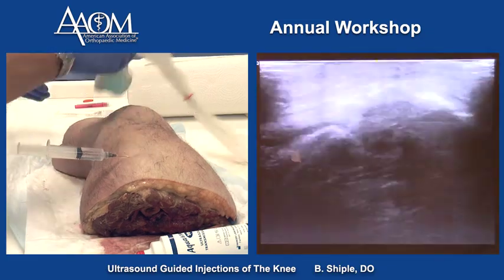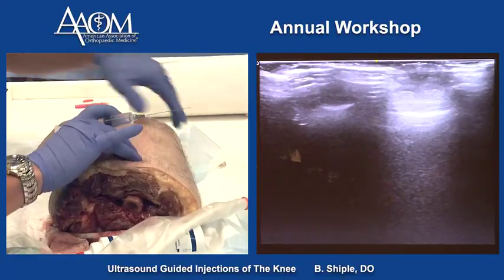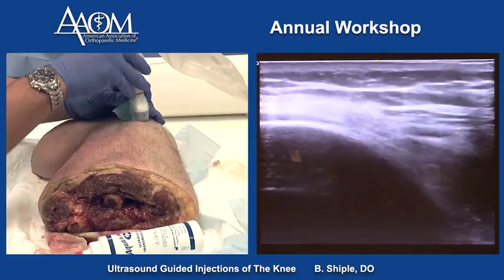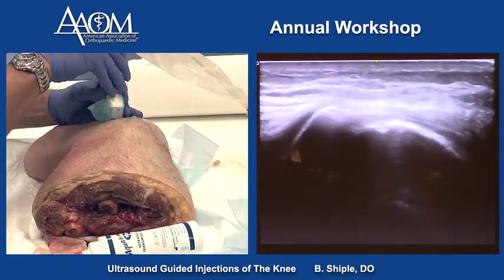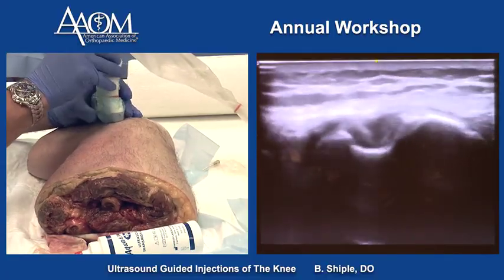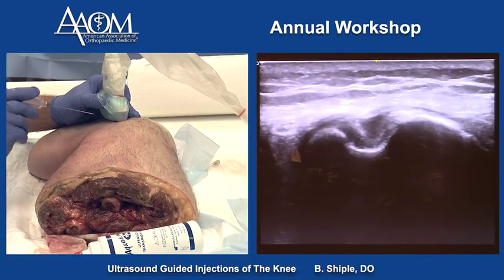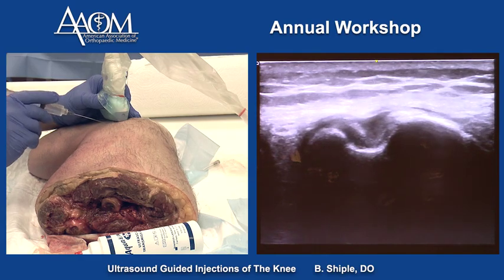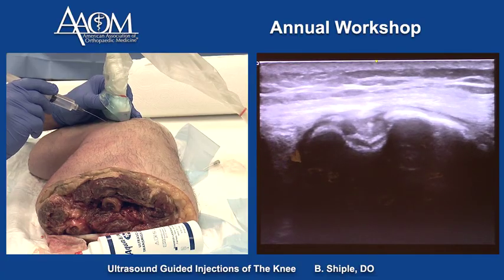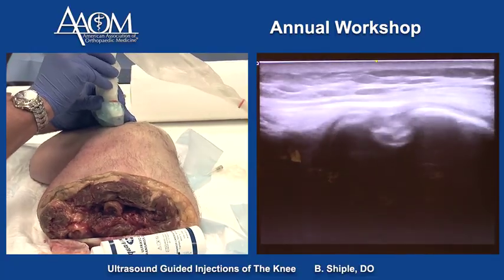The next technique on the lateral knee is a short axis technique to get the needle into the popliteus tendon. Make sure the probe is in proper position, put the tendon in the middle of the screen, and enter about a centimeter away from the probe. We go down into the tendon — that's a perfect position of the tendon.